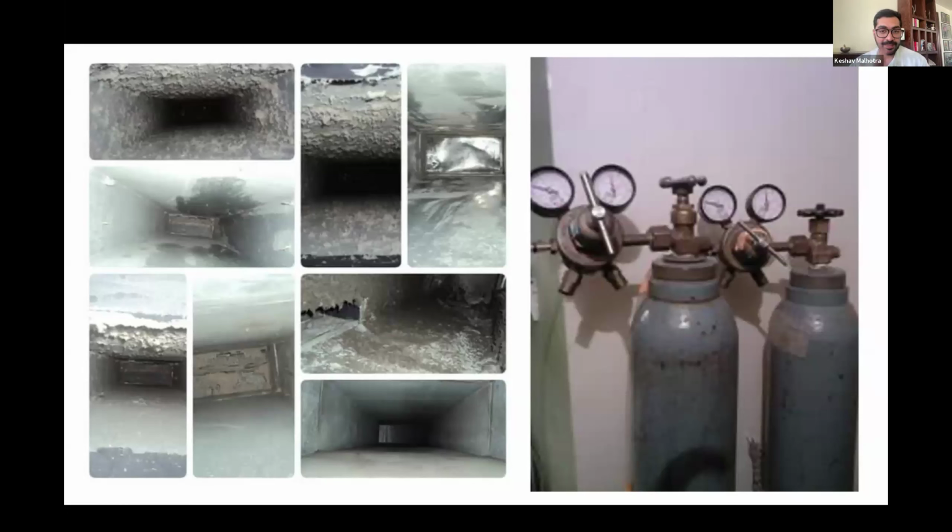This is a horrifying image for me. These are photos from within the vents of the HVAC, and look at how bad they get. Look at the amount of gunk that accumulates if you don't maintain them on a regular basis. This is a nice clean one, but all of the others are terrible. And that applies to filters as well. If the filters are not cleaned and replaced regularly, that's what happens.